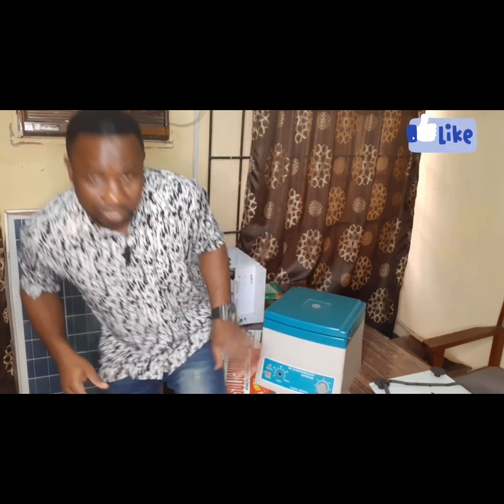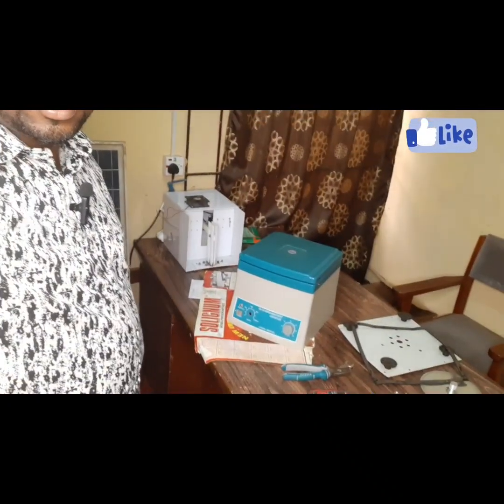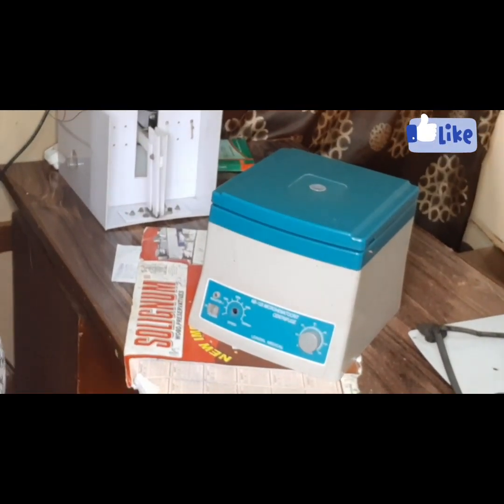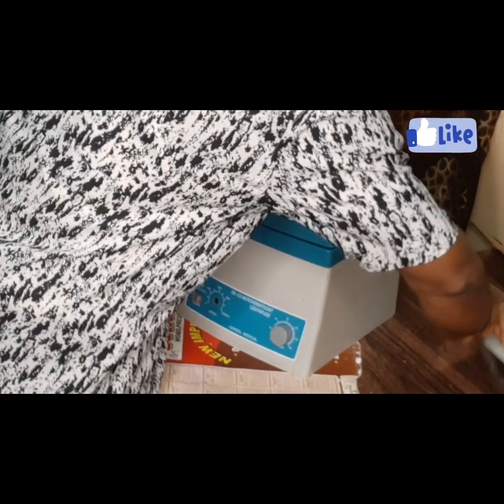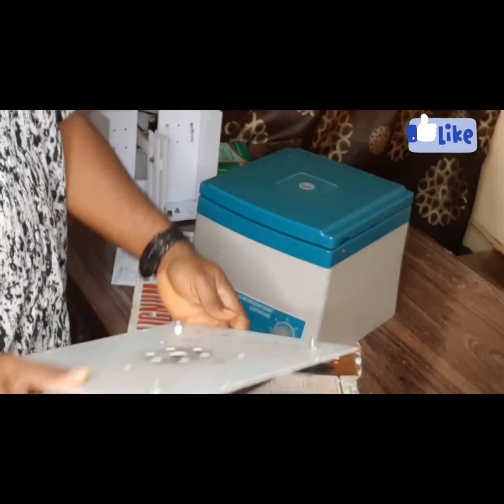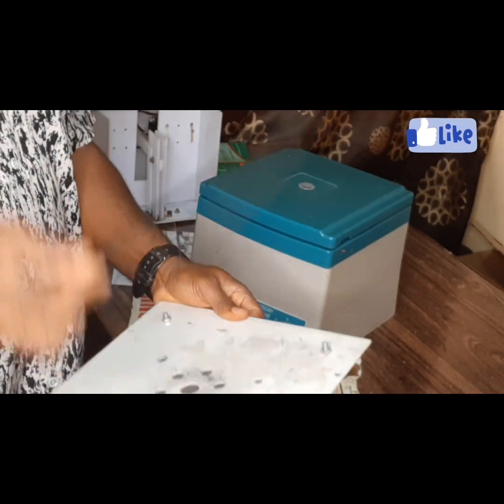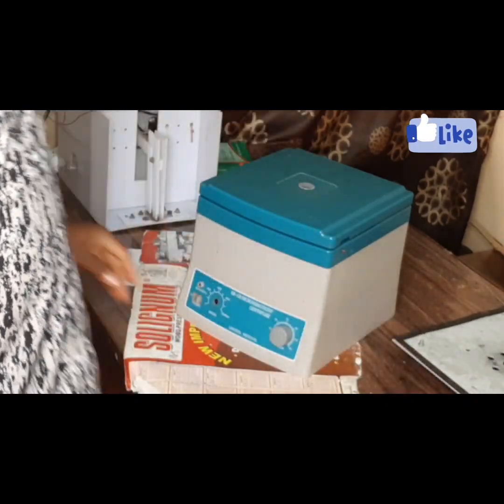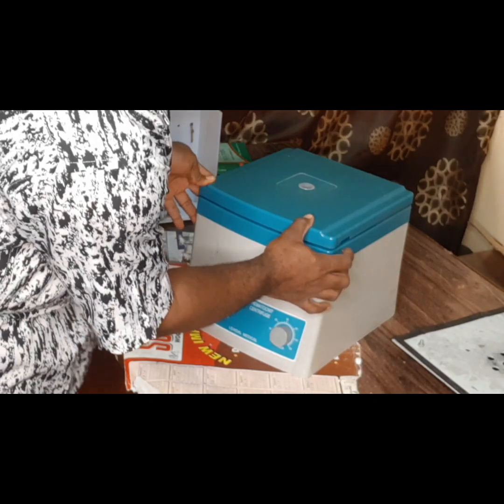So let's go straight to the machine. Maybe I may need to increase this a little. Let me magnify it so that we can see it very well. So this is the machine. I've been able to loosen the back. This is the base, and the associated seal. It has a seal, you understand? All these things are important to minimize the noise and make sure that it's well covered.